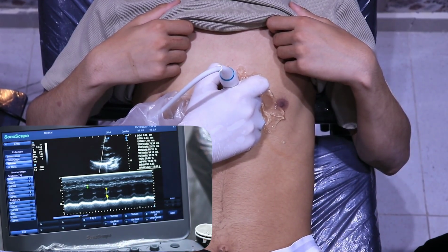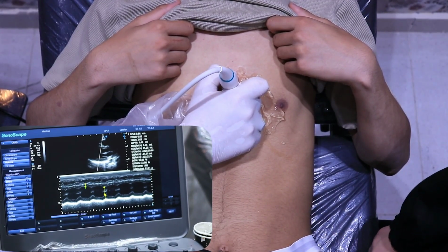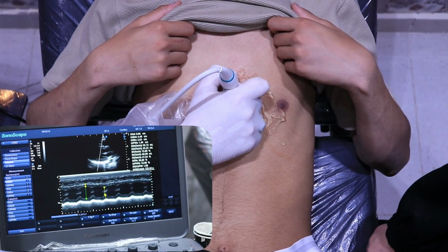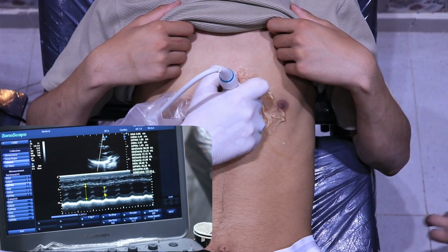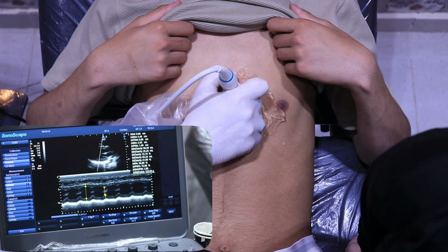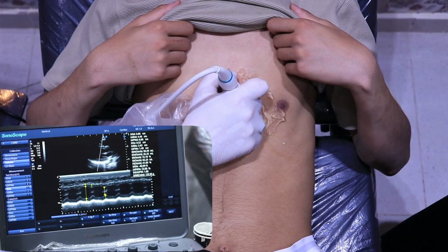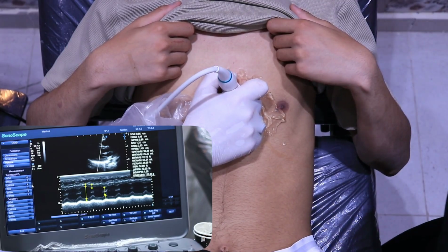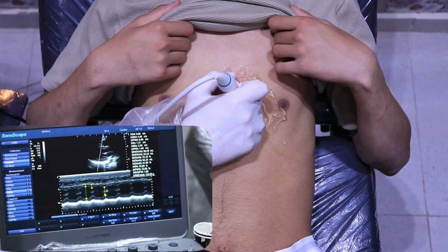انا هقيسها بقى بسرعة دلوقتي. Okay, this is the... بعدين هنشوف ال diameter. ايوه بعد كده الدايمتر internal diameter وصلنا لغايه البوستيريور وول، وبعدين نكمل على البوستيريور وول زي ما انتم شايفين اهو. ده البوستيريور وول بس ايه تبعد عن البريكارديوم. ناخد 4 دوتس وهو بيشتغل لوحده. هو بيشتغل لوحده على طول اوتوماتيك اهو. بس انا كنت بوريها لكم بالتدريب. هنا حضرتك ده كده، وهنا برضو هو هنا وصلنا للاي في اس during systole.